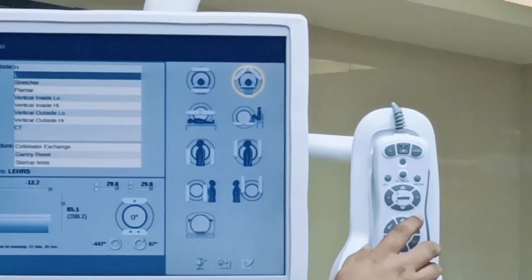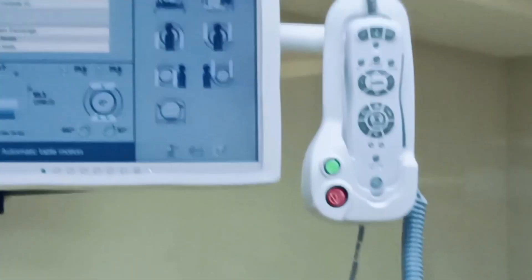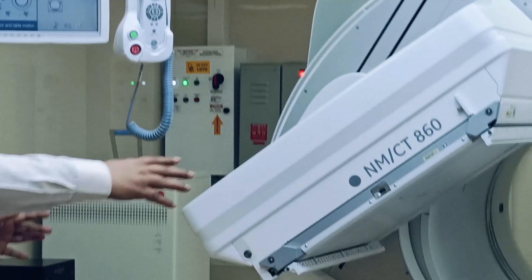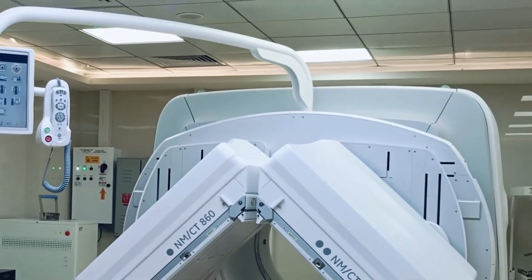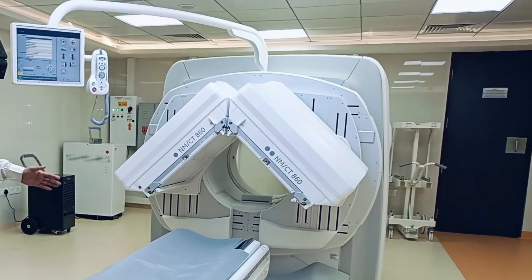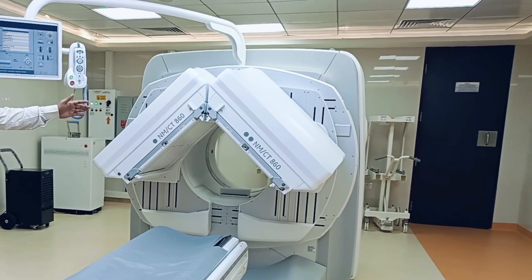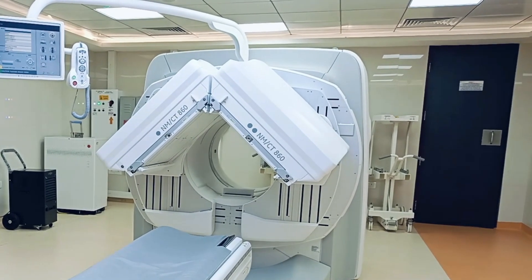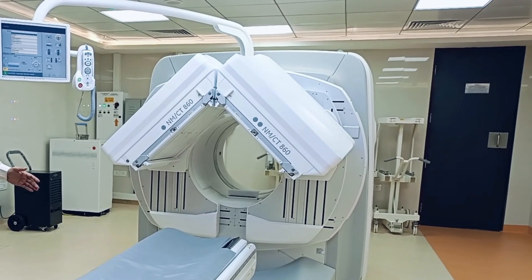Let's go to L mode first. Press set, but be careful — there should be no obstruction around the detectors to avoid collision. You can see the multi-dimensional movement: the table goes down and the detector takes the L shape and moves upward. In this mode, you can do all your cardiac scans.